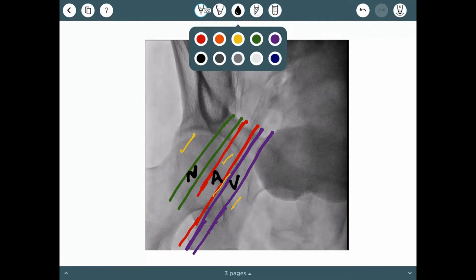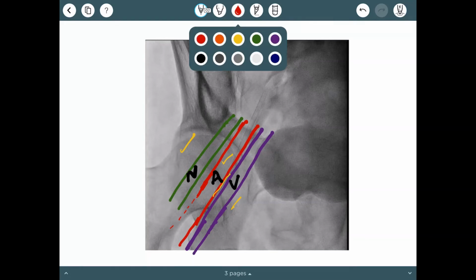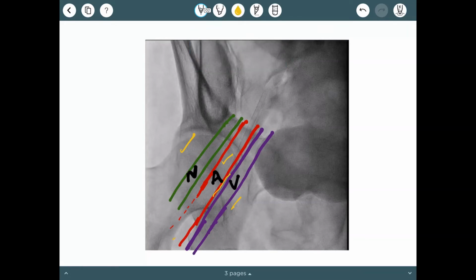the neck of the femur. So this is the neck of the femoral head, and you should always remember that when you are taking a femoral puncture, your needle should be aligned to this inner side of the neck of the femur. And if you go in this direction with the needle and you target the central part of the head of the femur, you will hit the artery in almost most of the cases.